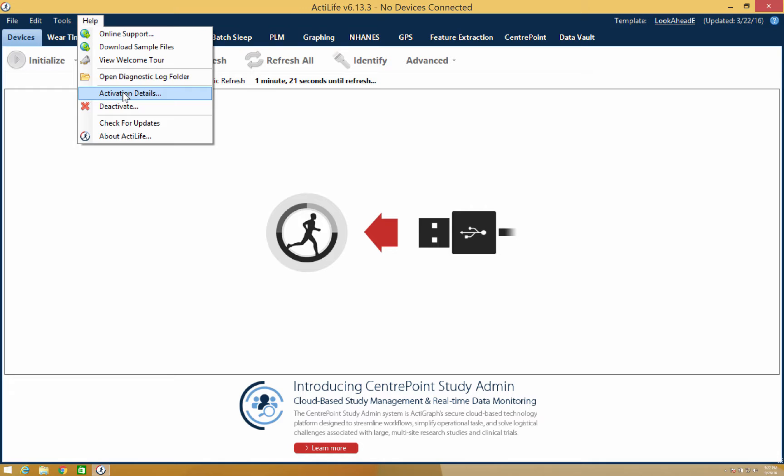And finally, under the Help tab is where you'll be able to check to see if there are any new updates available for your license.